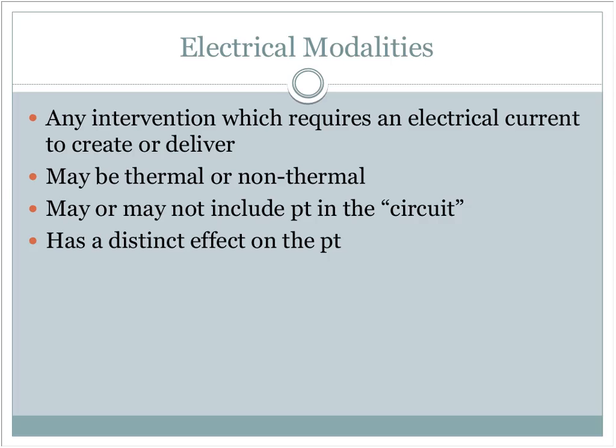Again, with E-stim for muscle contraction, or TENS, the electricity will come out of one pole of the channel. Usually every channel has two leads. The electricity will come out of one, pass through the electrode into the patient, and return through the other lead. So that has the patient as part of the circuit.